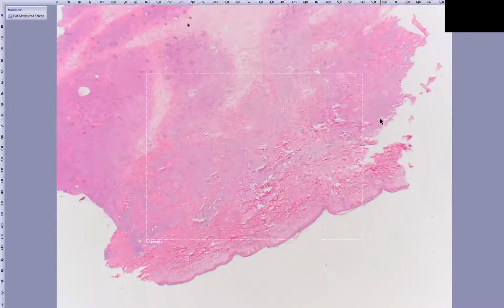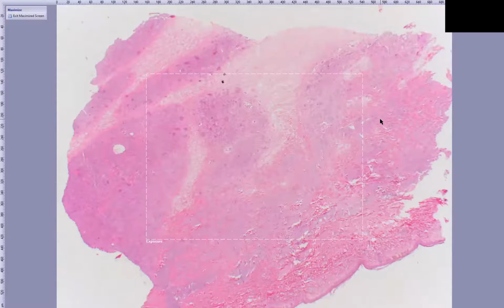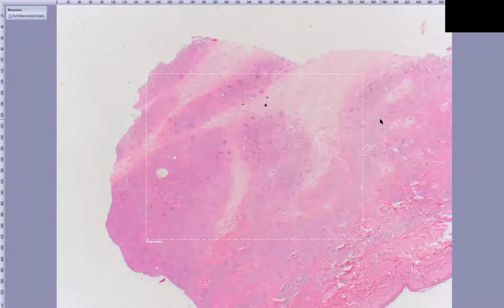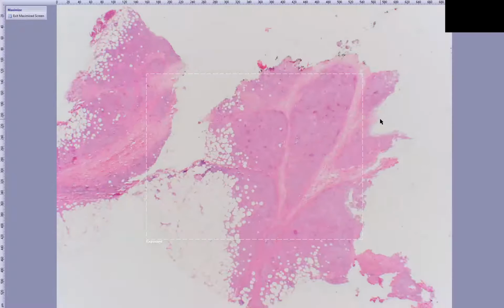And that's because the infiltrate in necrobiotic xanthogranuloma is situated in the mid to deep dermis and can even extend into the subcutaneous tissue. In fact, it frequently will do that. And in this example, the specimen is fragmented, but I do show you subcutaneous tissue with the granulomatous infiltrate extending into the subcutaneous tissue, which is typical for necrobiotic xanthogranuloma.